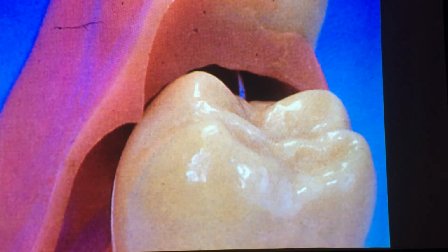Some of you made your dentures so loose that they would fall out, and some so tight that they would bind. In chromium cobalt technology, we're going to measure that undercut. We're going to block it out. It's going to be perfect. We have no time to over adjust. There's still adjustment as it is with the shrinkage from the casting process, etc., and all the duplication, that we just can't go ahead and be vicarious by filling in these undercuts with chrome and expecting to relieve them all.